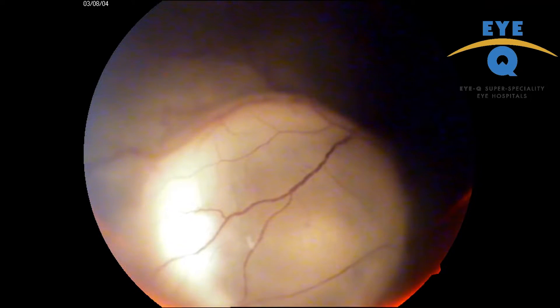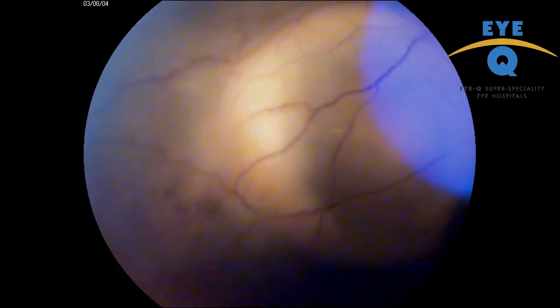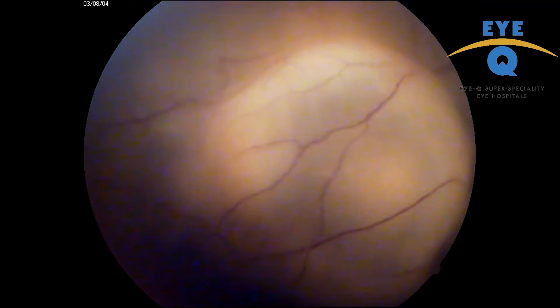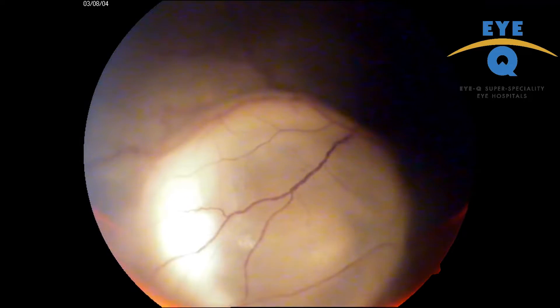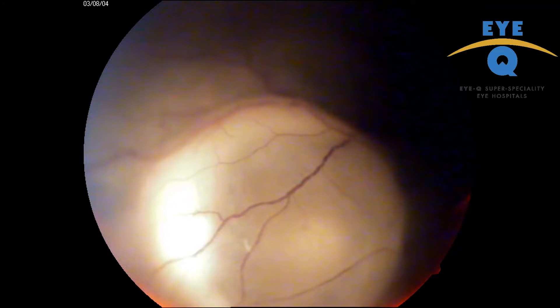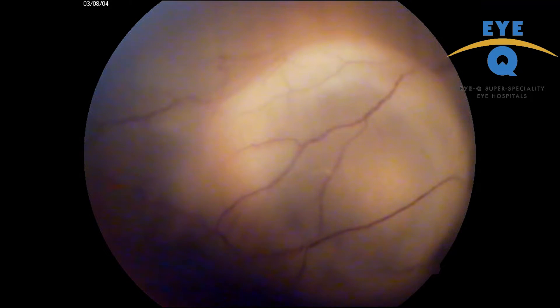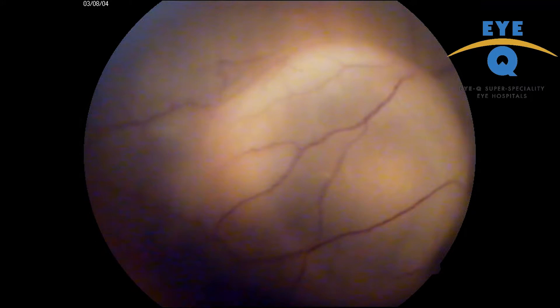This video of sub-retinal cystic surcosis was shot in 2004. The idea was to capture the characteristic peristaltic movement of a live cyst and share it with fellows so that they can always diagnose it easily whenever they find one.